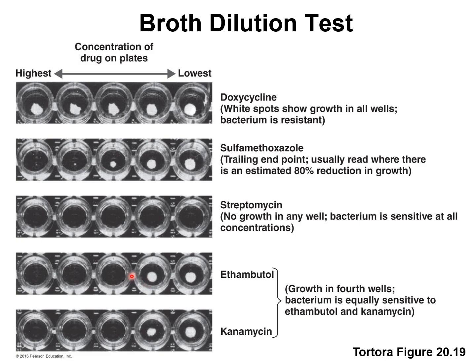If we look here, the MIC levels would be somewhere here on the medium concentration range. Depending on what those levels are, if you can reach above the MIC level in the body, then sure, they would be fine to choose and they would treat the infection. But if you can't get above those MIC levels, then you don't want to use those. They won't treat the infection. So the bacteria would be resistant to those.